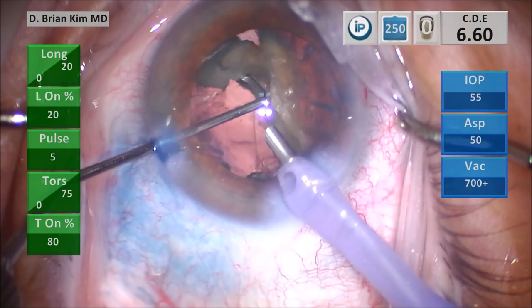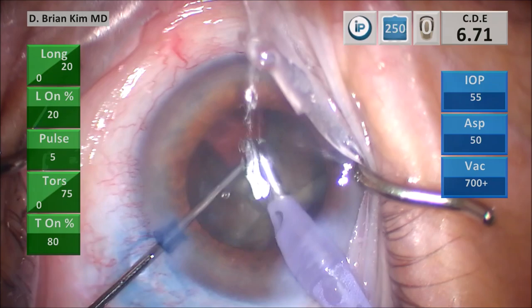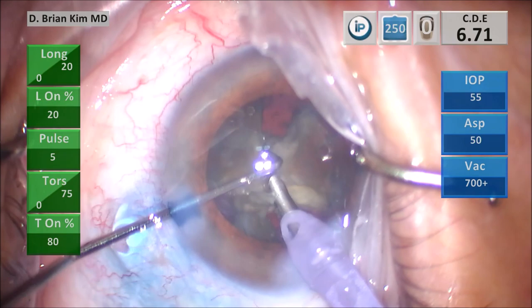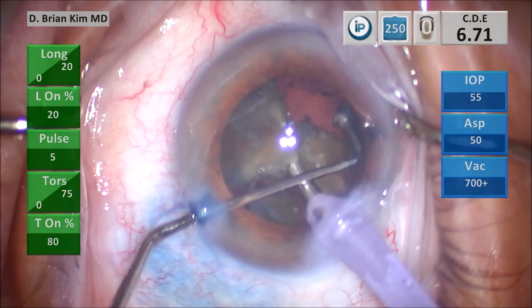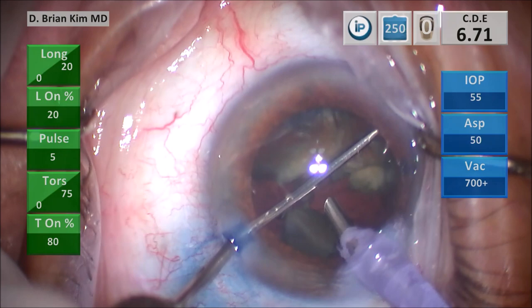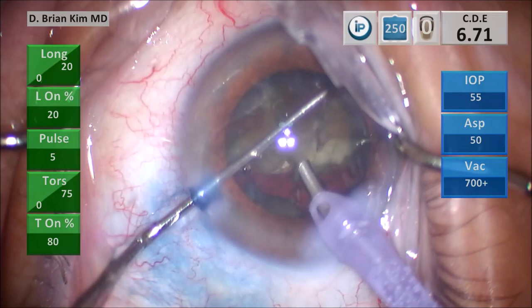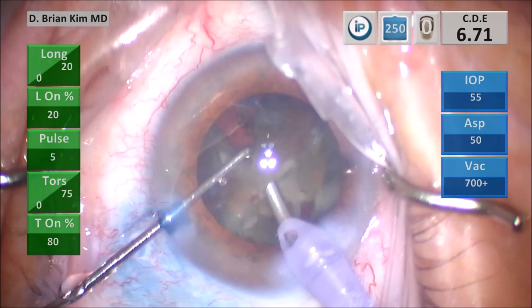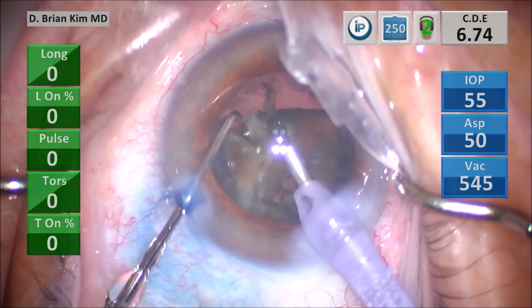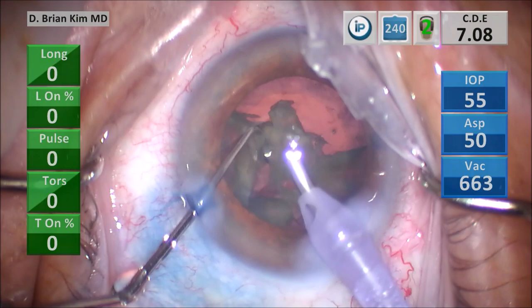I place the chopper around the second hemi-nucleus, placing the phaco tip deep in the bag, and then I'm dividing the lens in half very carefully and slowly, making sure I'm separating even the deep adhesions. I don't prefer to lollipop the lens using ultrasonic energy to impale the lens piece — I prefer to use mechanical fracturing forces to crush and divide the lens pieces rather than using ultrasonic energy. Once I get the lens separated, I use a little vacuum to hold the piece, crush it between the chopper and phaco tip, and keep using crushing forces to make pieces smaller, emulsifying with high vacuum and ultrasonic energy.